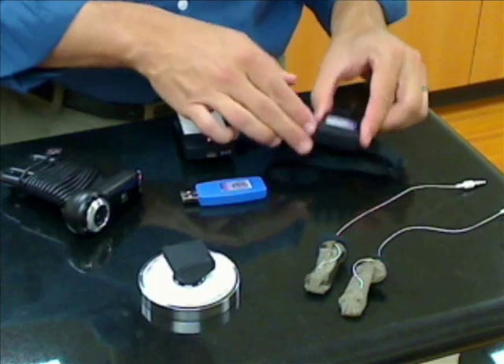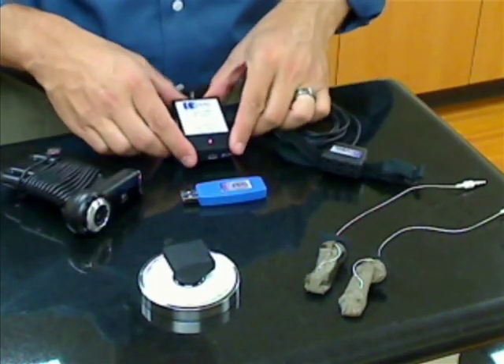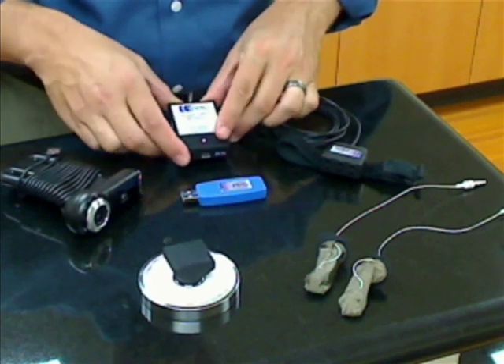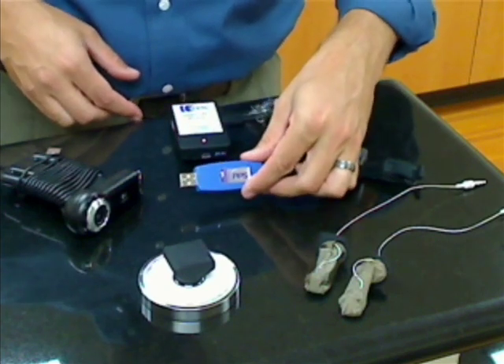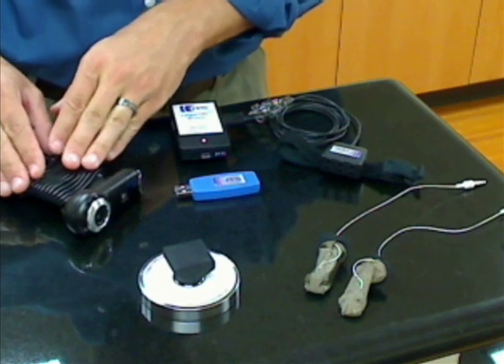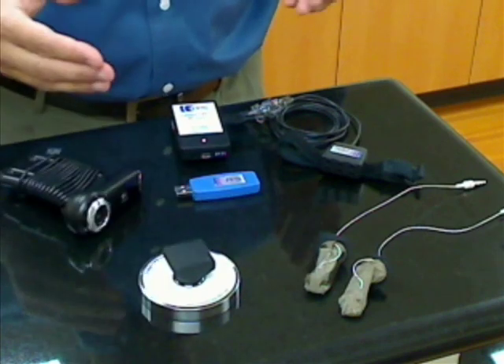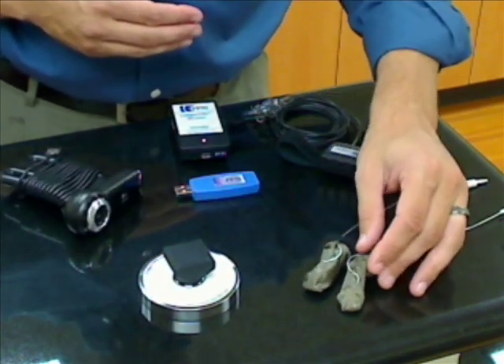Fingertip systems include a wrist module for connecting up to six sensors, a rechargeable Bluetooth interface, a USB Bluetooth adapter for the PC, a high-resolution webcam for collecting synchronized video, a USB reference sensor for calibration, software, and an assortment of fingertip sensors.